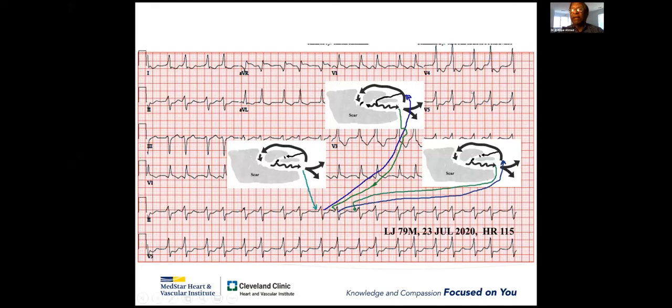Yes. If it was AF with WPW, the diagnostic criteria are irregular RR and irregular QRS width. In this patient, the RR is irregular, but the QRS width is not irregular. Anytime we find something with wide QRS tachycardia with irregular RR interval, if the QRS width is irregular, that is WPW with accessory pathway conduction during AFib. But this one is basically not WPW syndrome.